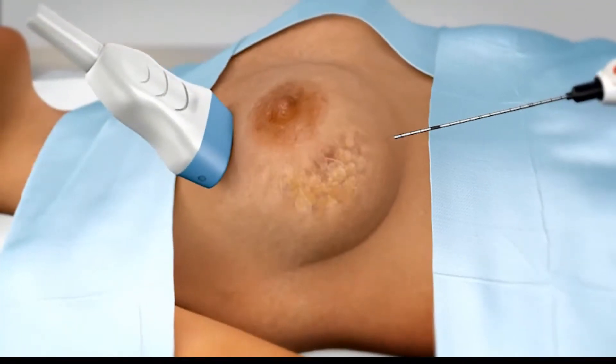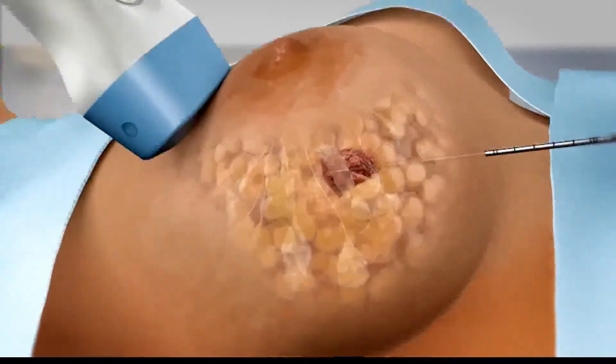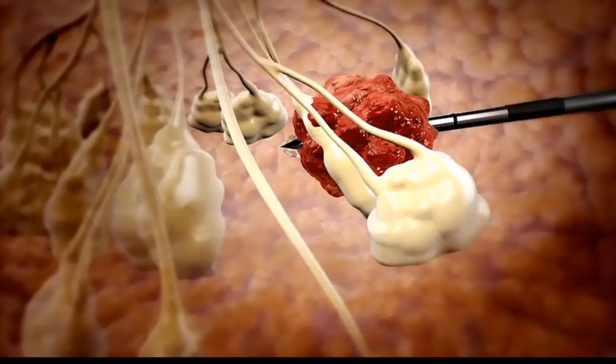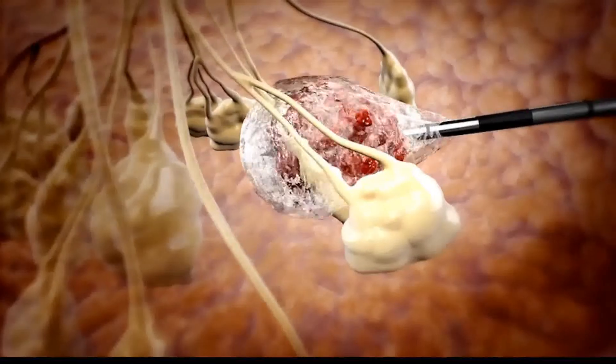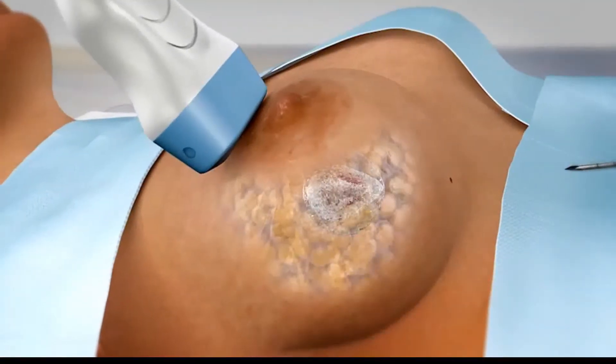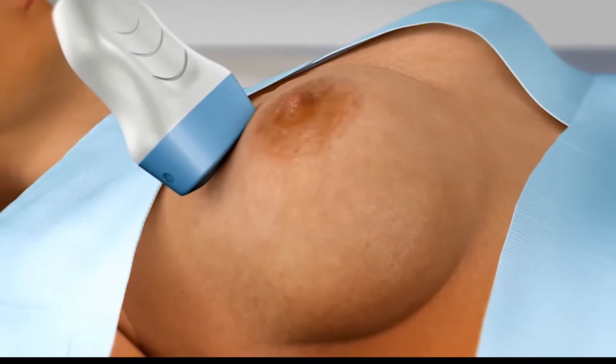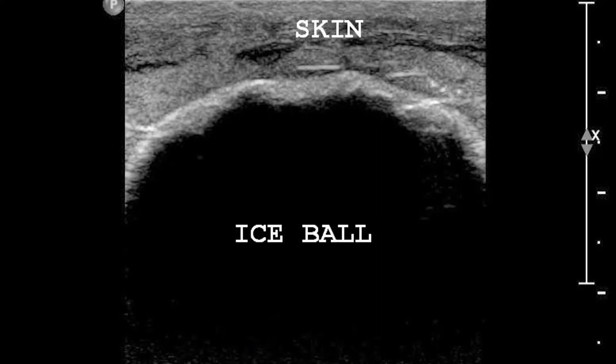It is quite simple. We numb the skin first and then we put the cryo needle through the skin into the tumour under ultrasound guidance. After we activate the cryo machine, a large ice ball is formed. On ultrasound we can monitor this ice ball and we can see that the ice ball is totally covering the tumour.